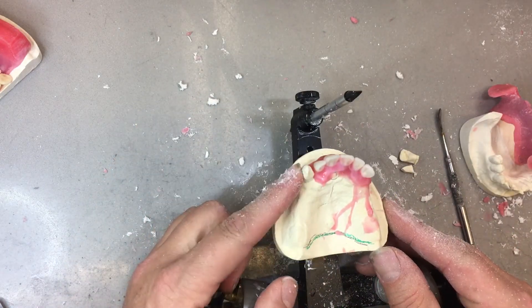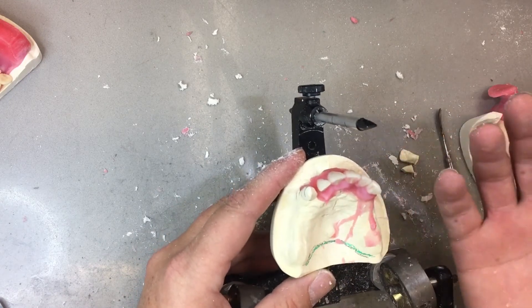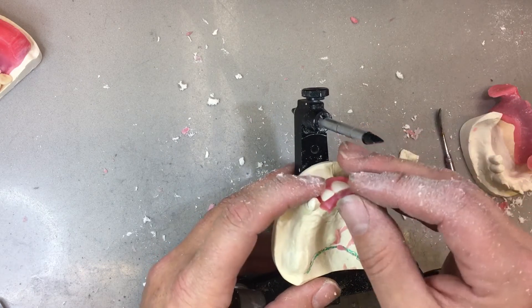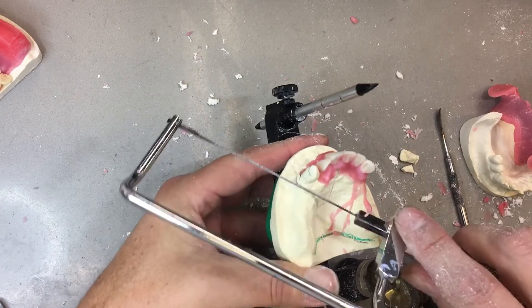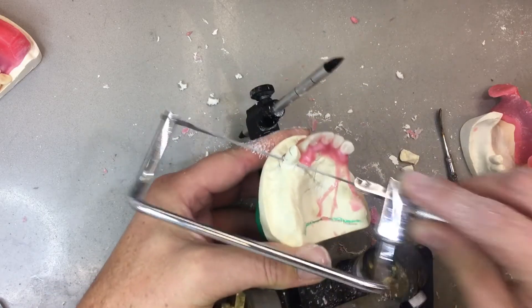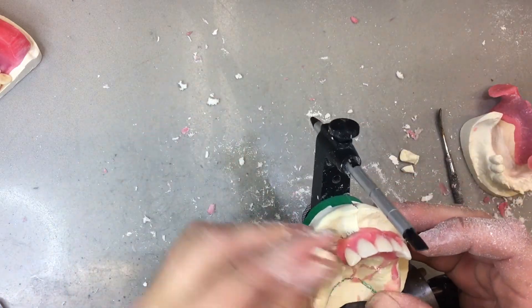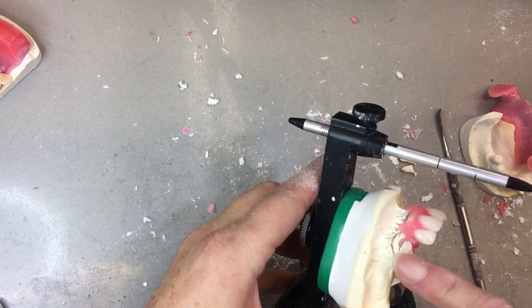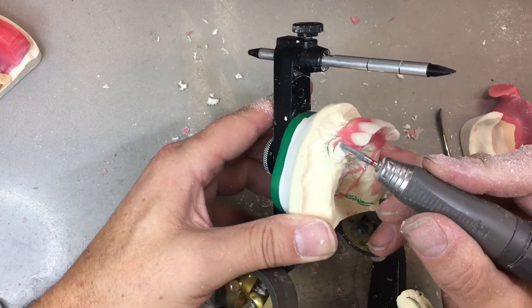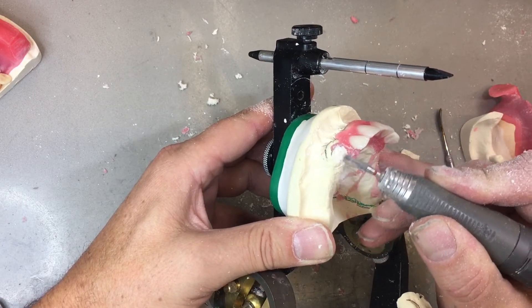I still have the canine left. Basically, I'm doing orthodontics with my prosthetics, putting their teeth in the more neutral zone of where they possibly should have been. So, extract the last one, tooth 1-3. I could snap it off, but I run the risk of losing some of the labial eminence, the buccal eminence, the canine eminence of the 1-3.